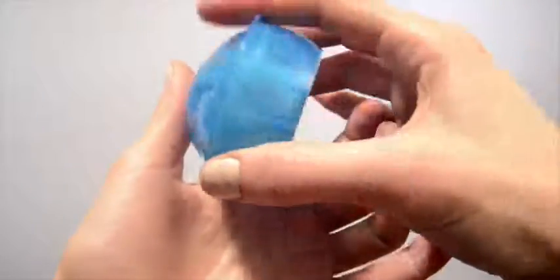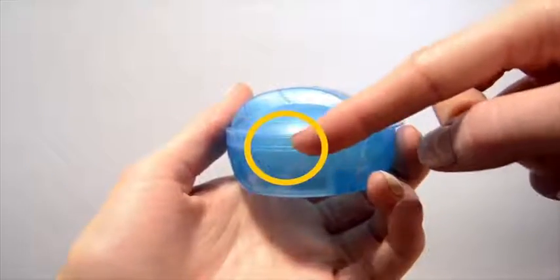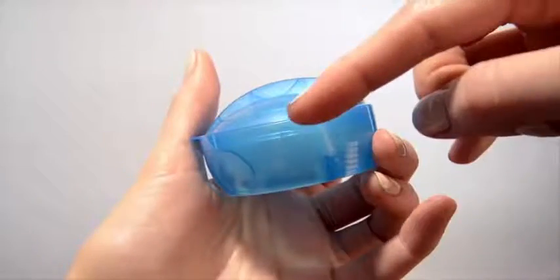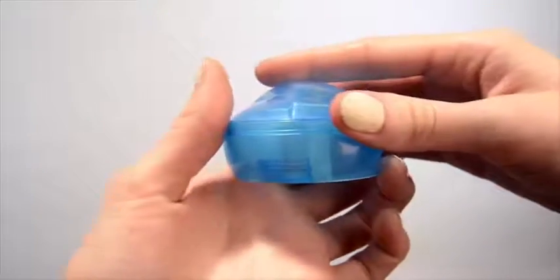Turn the device over and locate the three raised marks on either side of the lid. Squeeze the raised marks to remove the lid.